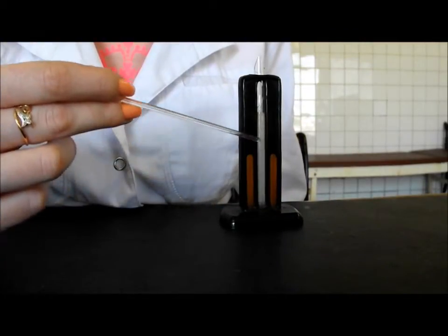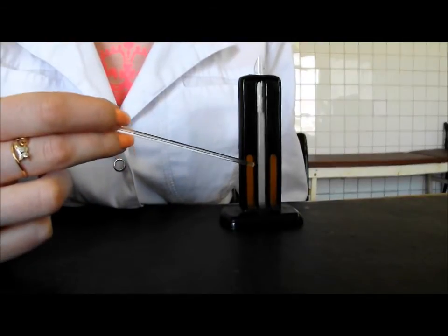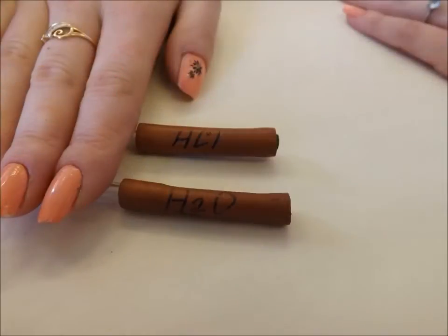The hemometer of Sali consists of the middle test tube and two tubes with colorful standards from each side. There are two pipettes for hydrochloric solution and for distilled water.